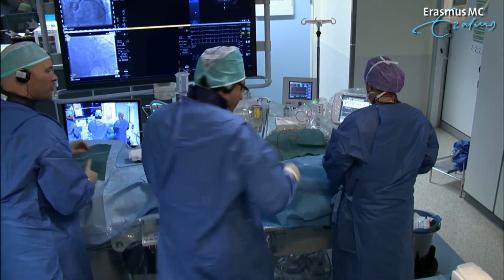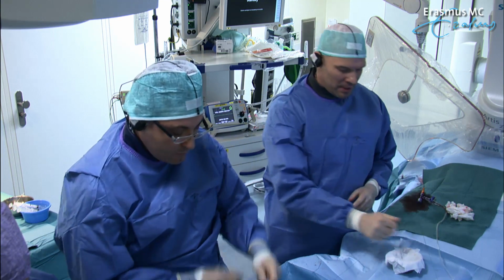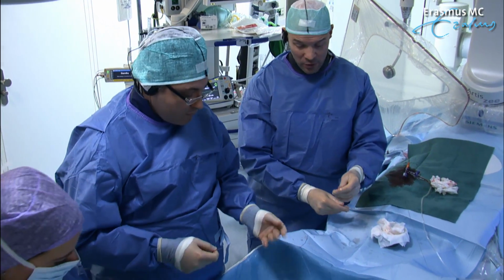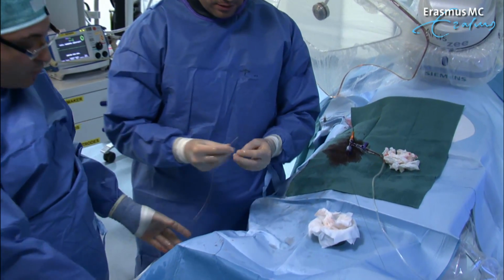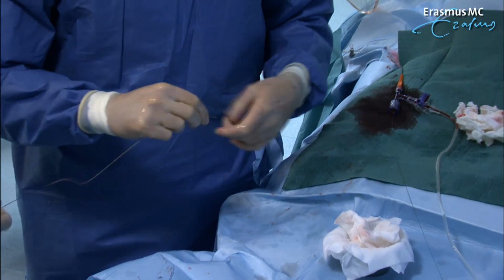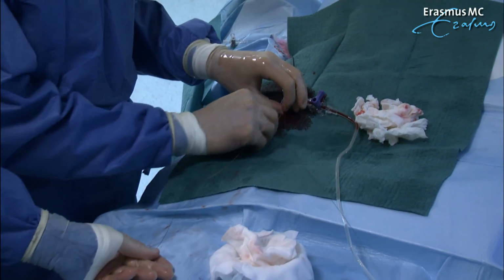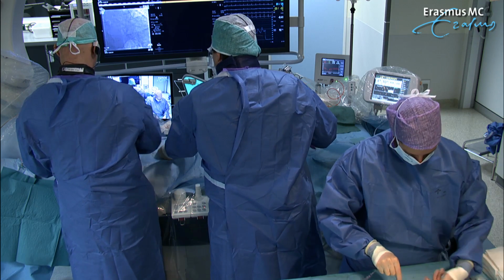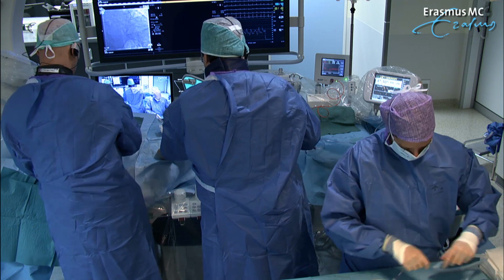In the meantime, I think we also need to consider our strategy relative to the LAD. What do we think about the mid-LAD portion? This is also something that we could evaluate by FFR and doing a pullback. Yes, I think we have the technology to do that, because we can maintain the access to the LAD while working, and after the stenting of the left main, we can assess the residual amount of atherosclerosis in the LAD, just doing a pullback there. Yeah. So maybe we can do that. The patient at this point in time is perfectly stable hemodynamically.